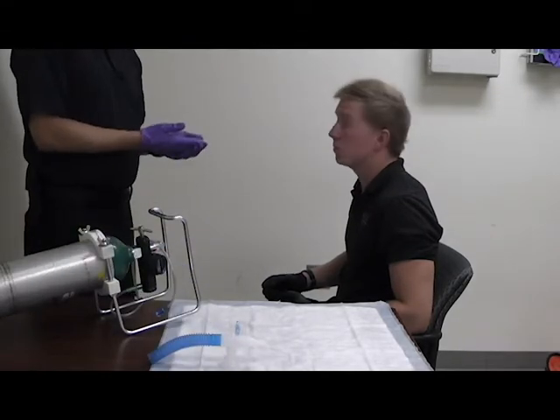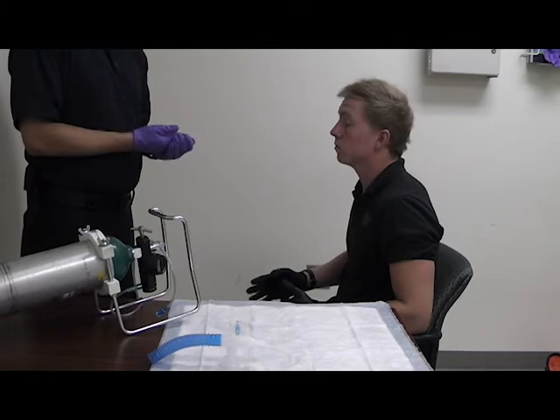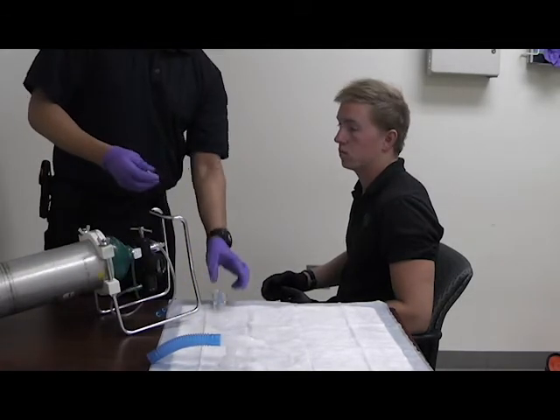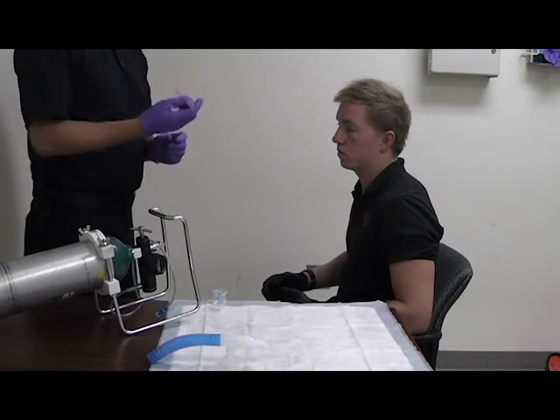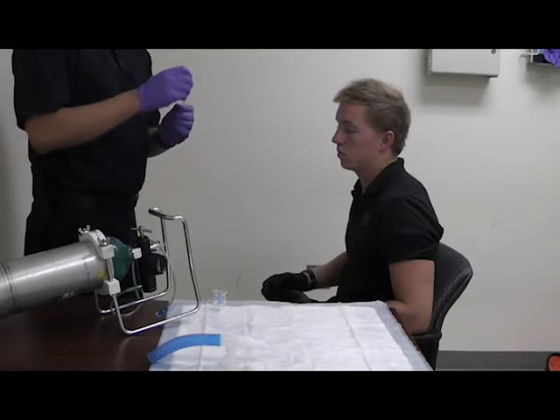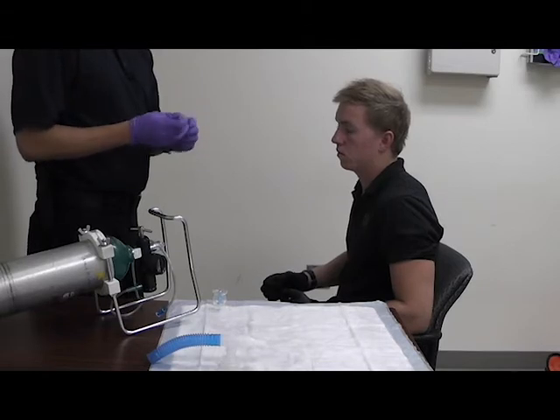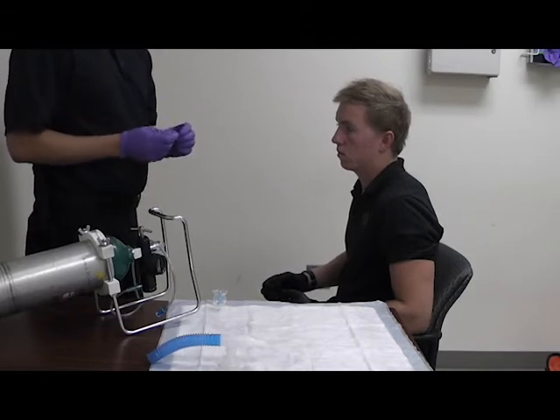Then I'm going to check if my patient has any allergies. If the patient does not have any allergies, I'll get my medication. We're going to run through NCCCE: this is the right drug, right color, concentration is good, clarity is fine, and expiration date is within acceptable limits.